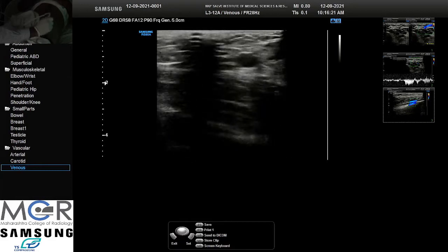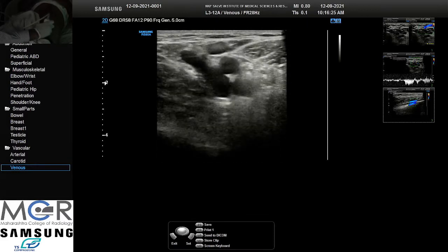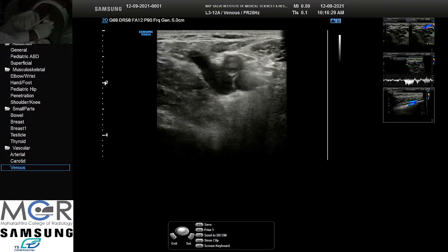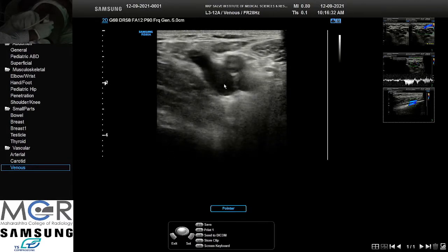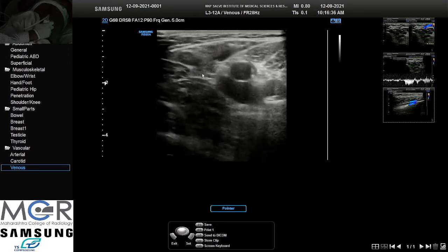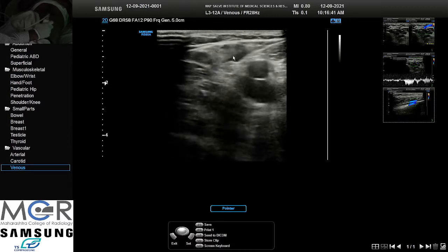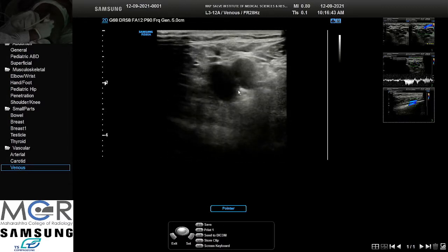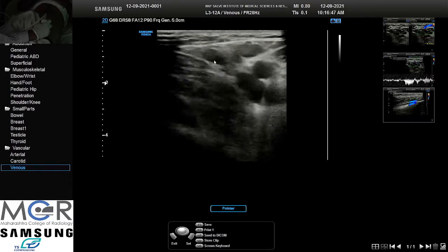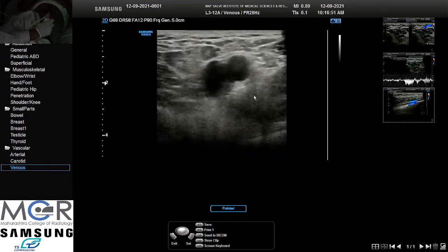So that is the saphenofemoral junction here. This is the Mickey Mouse sign, it is called. Femoral vein, GSV and the femoral artery. You can see that femoral vein. There are some nodes here, and very rarely the large nodes, they just compress this GSV and then cause dilatation of GSV. You should look for them whenever.